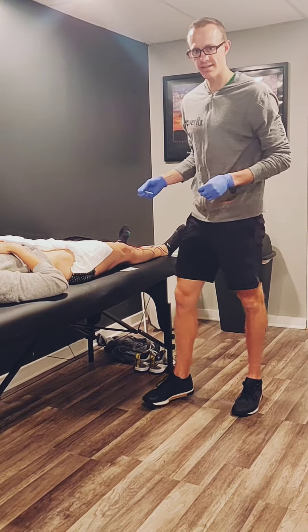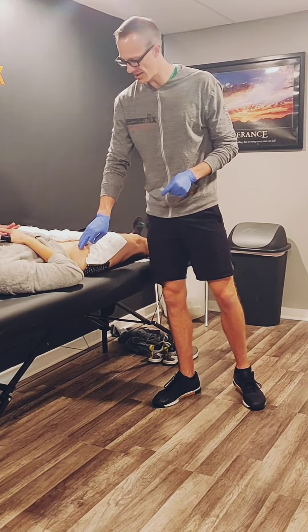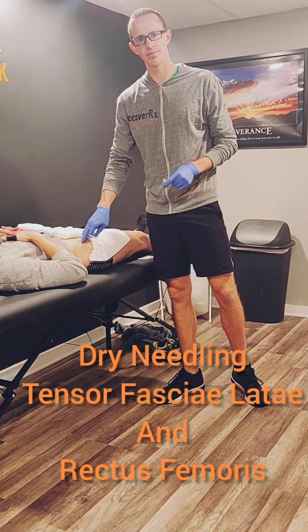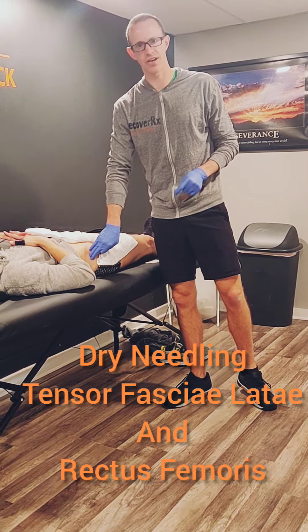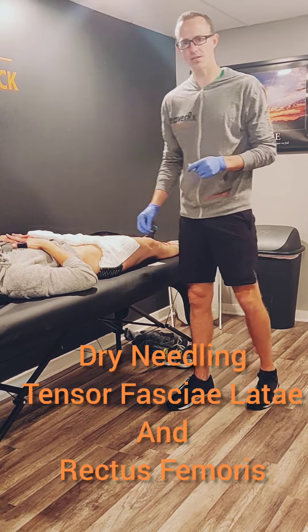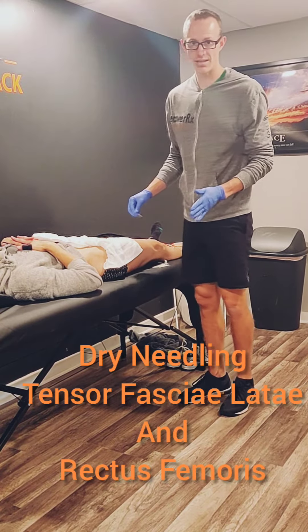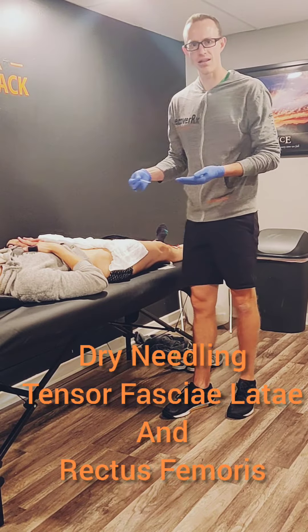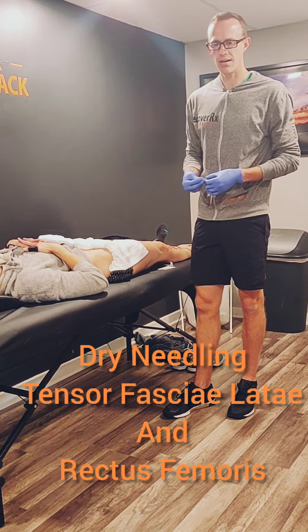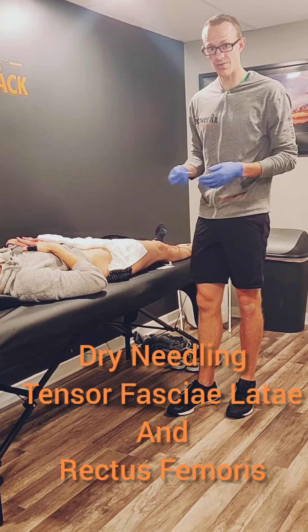What's up guys? Dr. Luke Greenwell here. We have our model, Violet. We're going to be needling her hip flexor, her rectus femoris — so proximal quad muscle — and then her tensor fasciae latae. We typically use dry needling to address muscular trigger points in the tissue, which helps with resetting that muscle, allowing it to fire like it should, and can be very beneficial for performance, as we've utilized with Violet in the past.